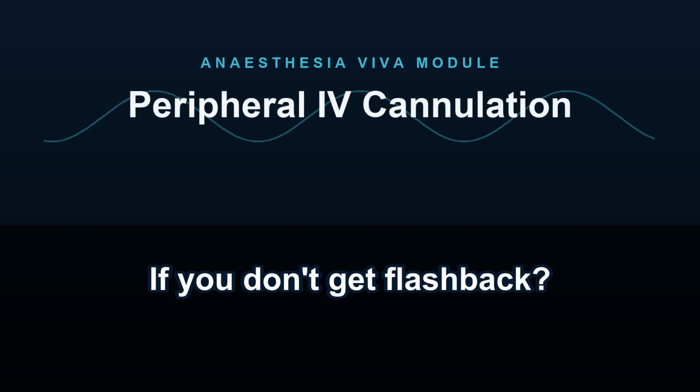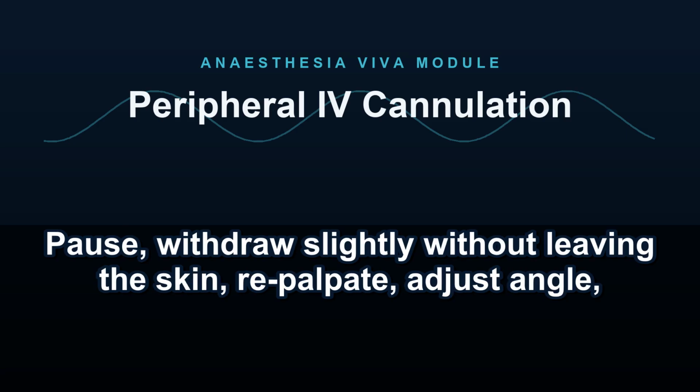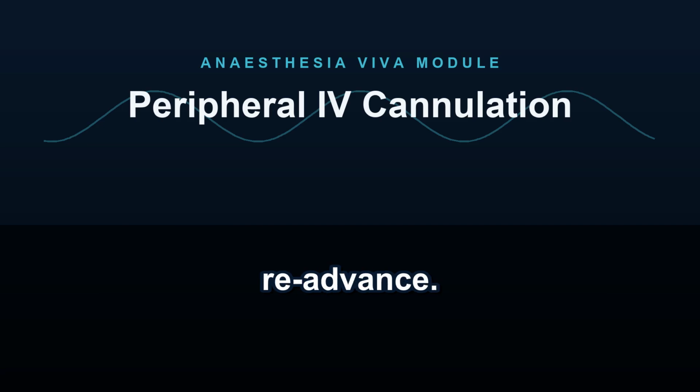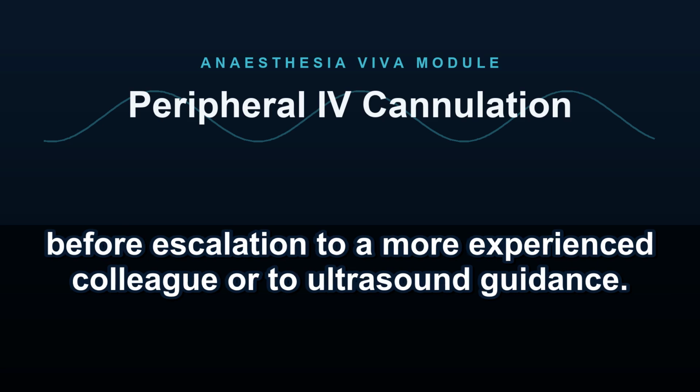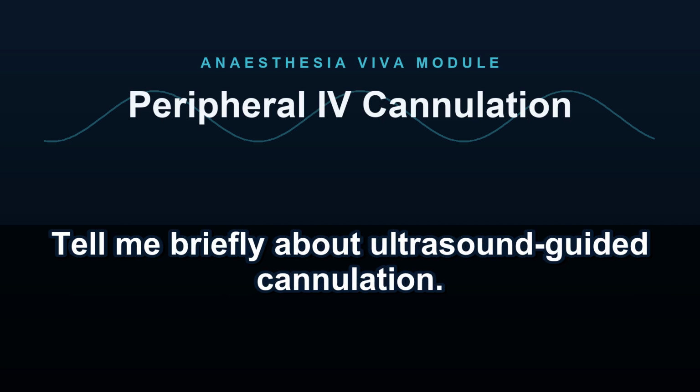If you don't get flashback, pause, withdraw slightly without leaving the skin, repalpate, adjust angle, re-advance. NICE and Royal College guidance is a maximum of 2 attempts per practitioner before escalation to a more experienced colleague or to ultrasound guidance. Tell me briefly about ultrasound-guided cannulation.